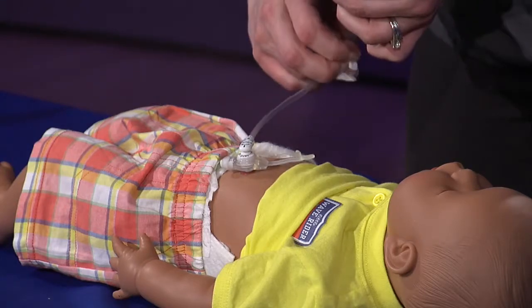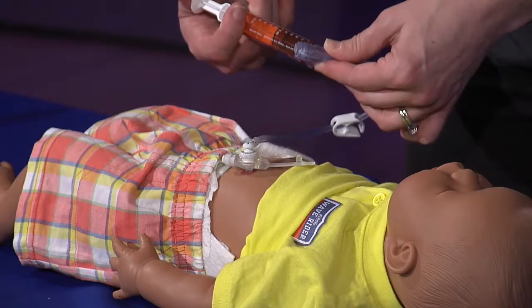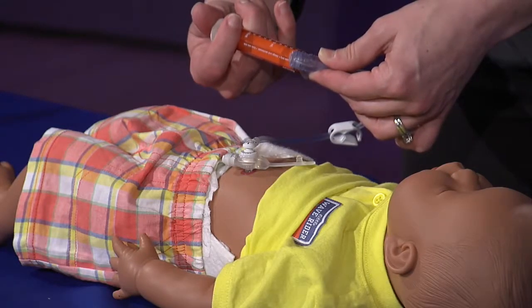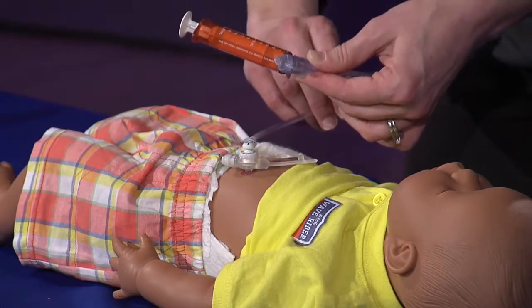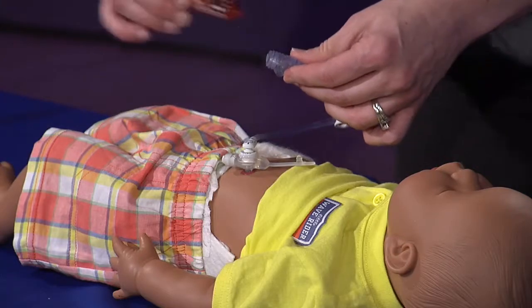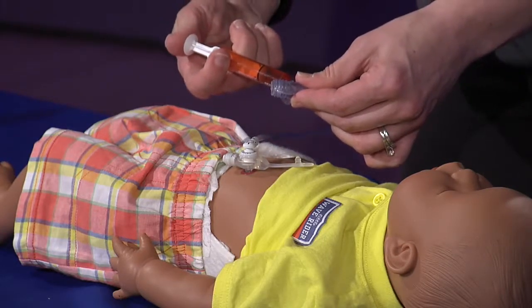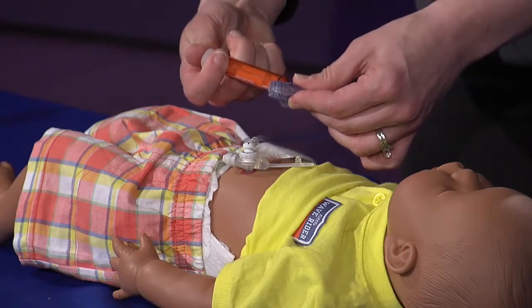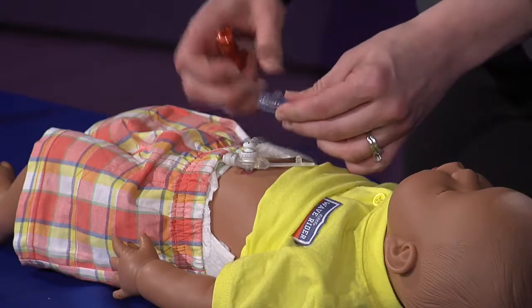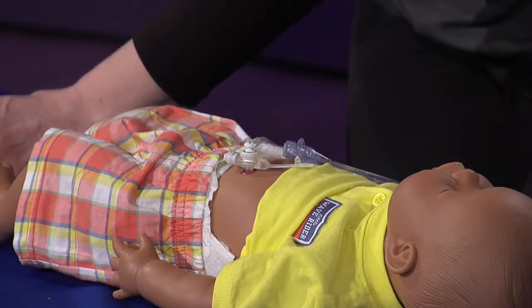Unclamp the extension tube. Slowly push the water into the tube. If there are no issues flushing the tube, you may repeat the process with the medication. Be sure to clamp the tube between each medication and flushes to prevent leakage of medications or flushes. Flush the tube with water after giving the medication.